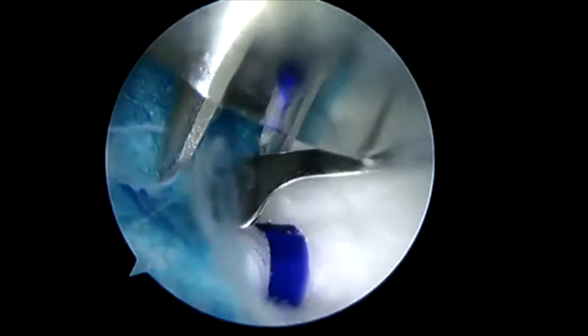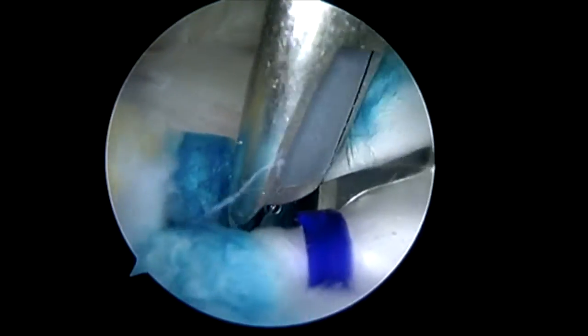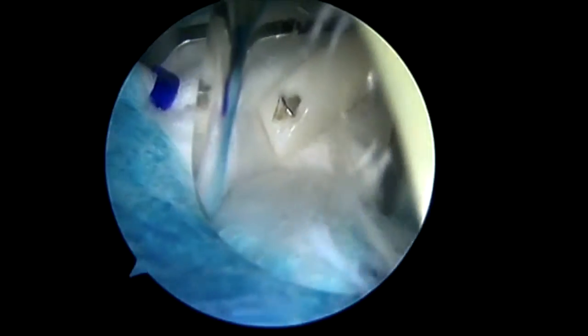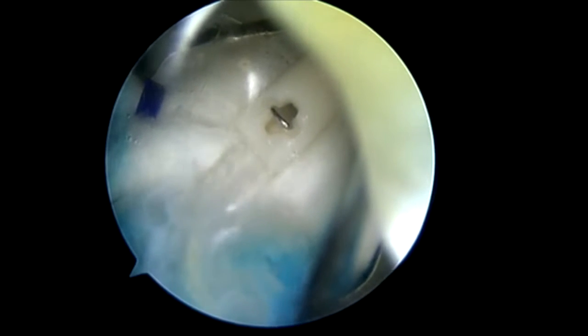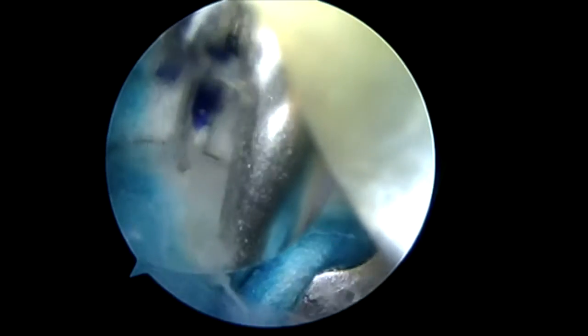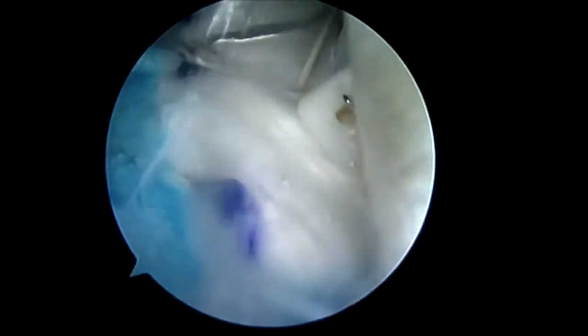The tendon staples are now introduced. The legs are pushed down through the rotation patch and the absorbable staples inserted. You want to take care to ensure that you do not bridge your metal delivery arms, otherwise you'll run the risk of removing the patch as you're trying to pull out the delivery device. These cannulas, which are included in the kit, allow us to clearly visualize our legs as we push them down through the rotator cuff and push out our deployment staples.